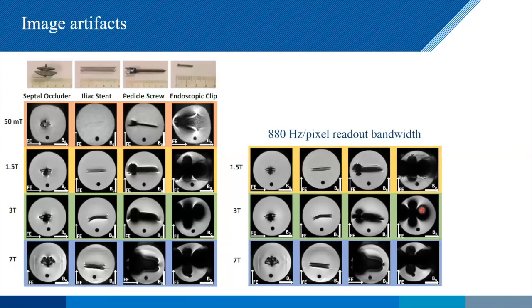And also in terms of image artifacts from medical implants, even if the medical implant is safe, it doesn't mean that your image is going to have any diagnostic use whatsoever.